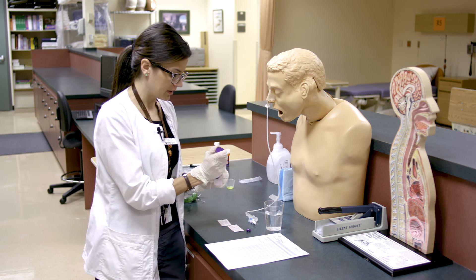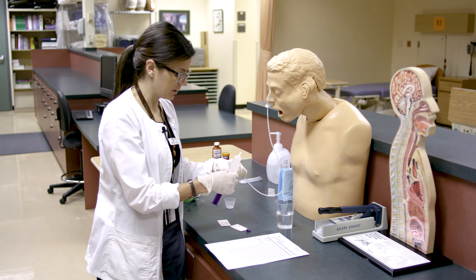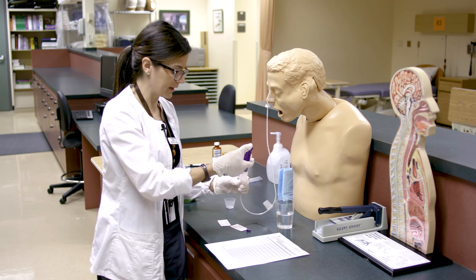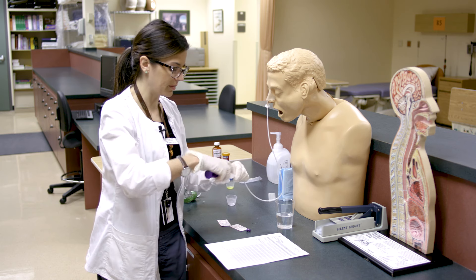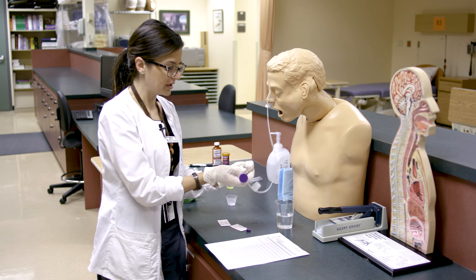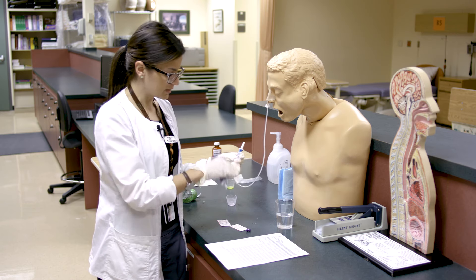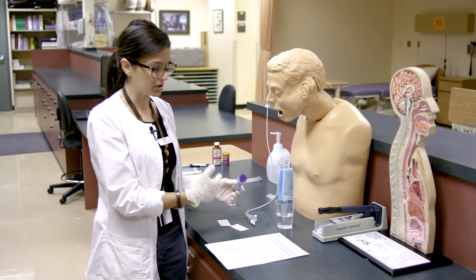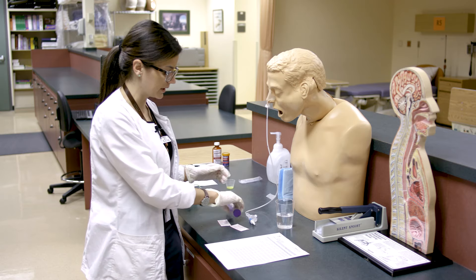Now we'll go ahead with the Benadryl — mix it up as you draw it up. We have about 30 mLs here with the Benadryl, which is quite a lot, so you'd want to try to do less than that. Then move on to tap water and instill more until the tube is clear and all medication is in. This illustrates why liquid medications are much more beneficial — they help prevent clogging and medication remnants in the tube.